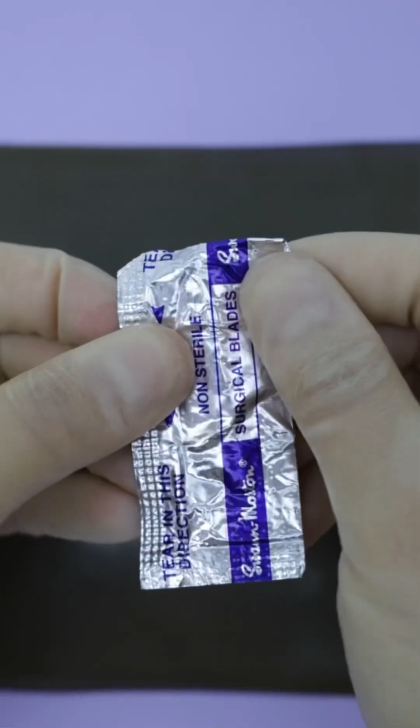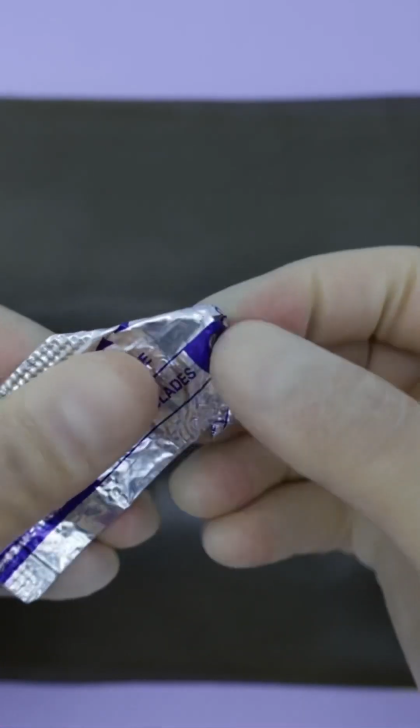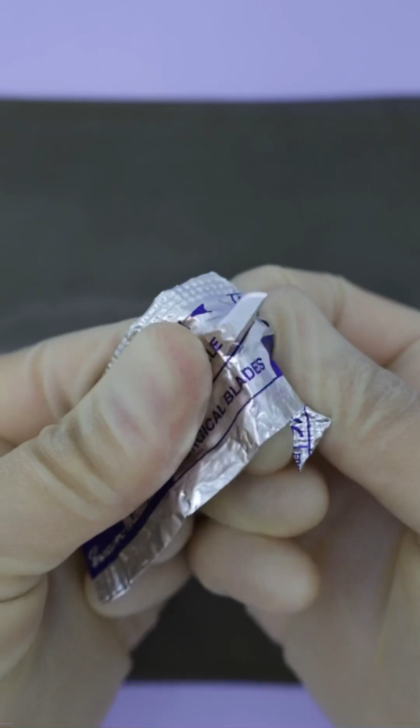Check the orientation of the blade in its packet and fold it to create a point on the end that has the pointed end of the scalpel. This way, in an emergency, you will quickly know which side to open it from.